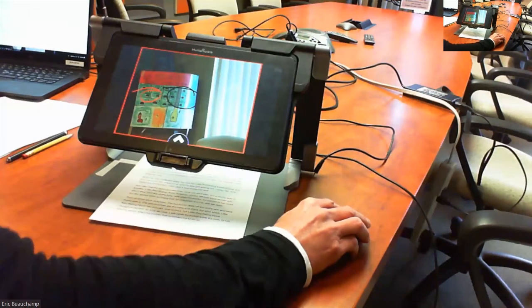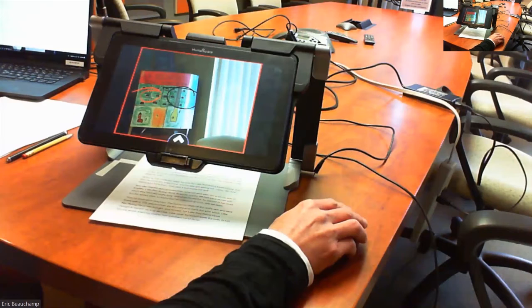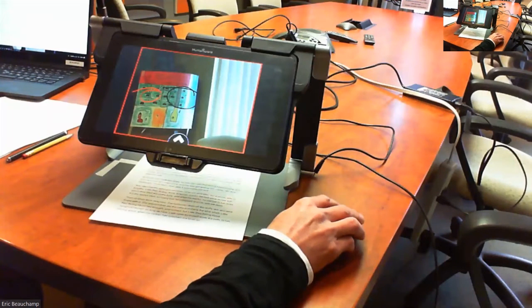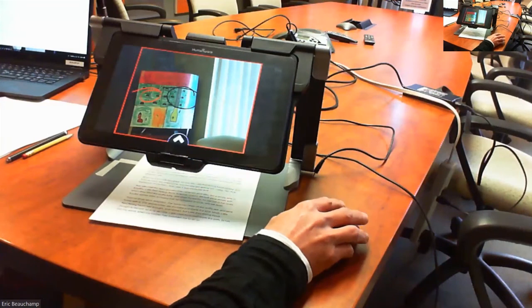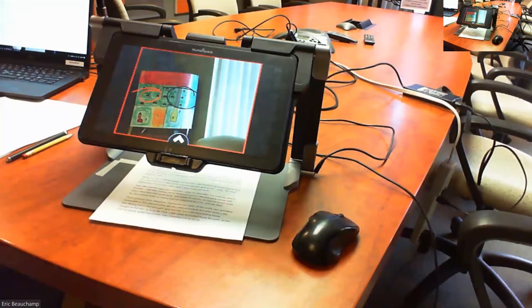Yeah, so if you want to just buy the camera, there are a couple of $100. You can buy some more cameras separately. Now, a lot of questions that I'm having lately is, can I connect my distance camera to an iPad?